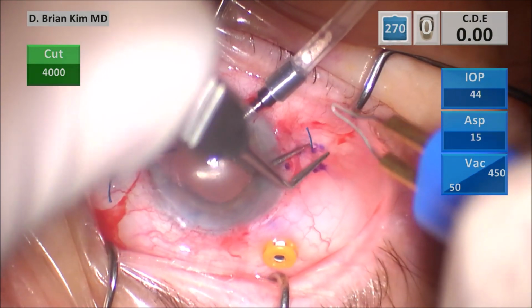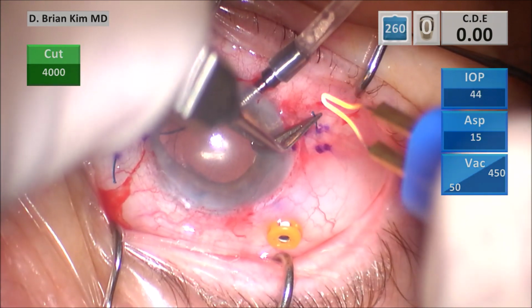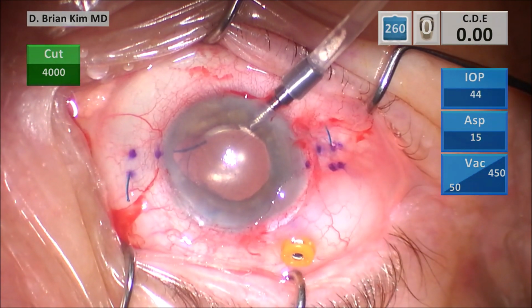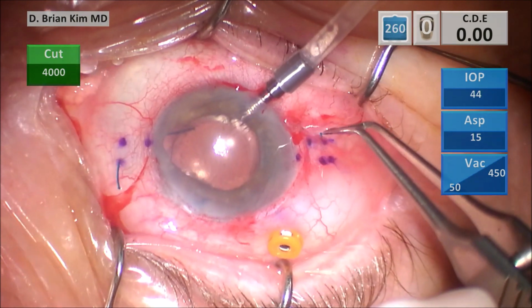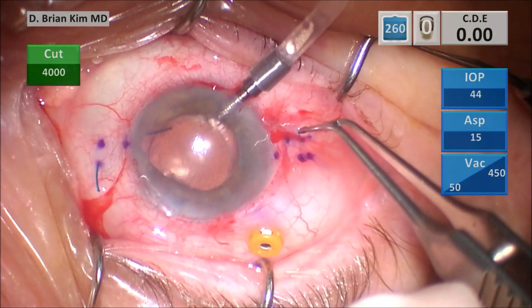And you can see the haptics are fairly flat. And when they're fairly flat to the sclera, that tells you you have a nice shelf, which means it's going to be an excellently positioned lens.